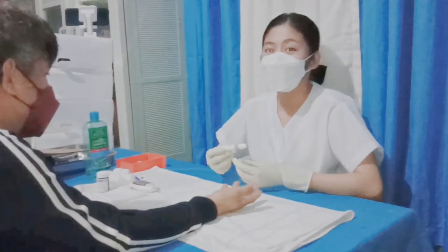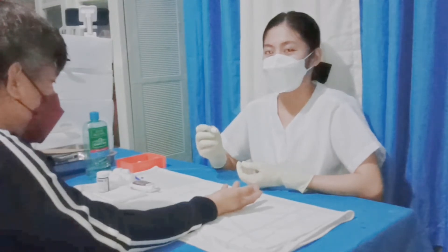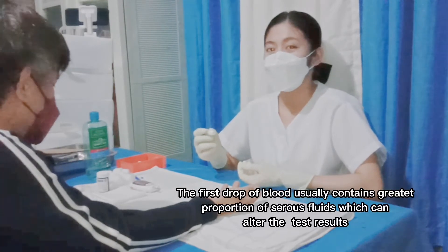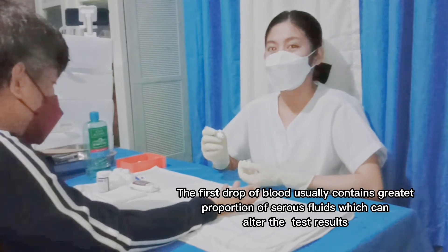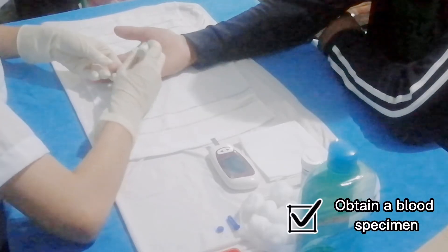Make sure that the lancet is perpendicular to the puncture site and that we should avoid any darting motion. Remember that we have to wipe away the first drop of blood because this usually contains a greater proportion of serous fluid which may alter the results. So I am now going to prick your finger.